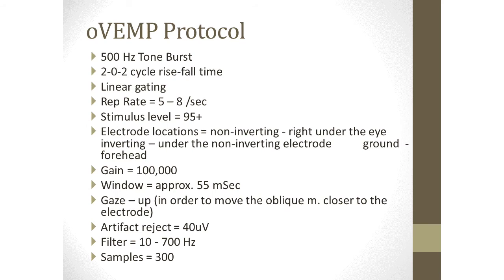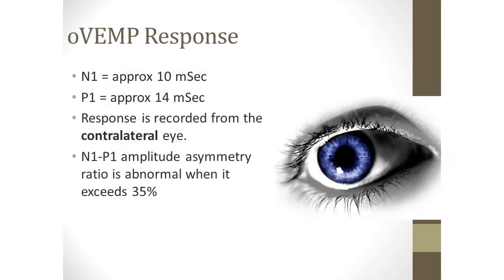And you're going to use the same exact protocol, except that the gain is going to go back up to 100,000, the same gain that you would use for an ABR or an ECOG. Otherwise, it's the same thing.